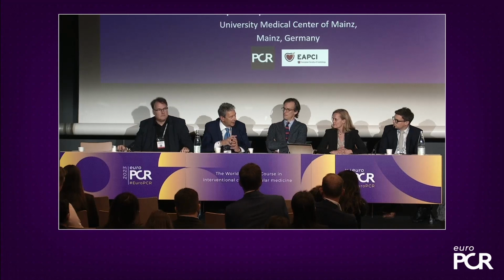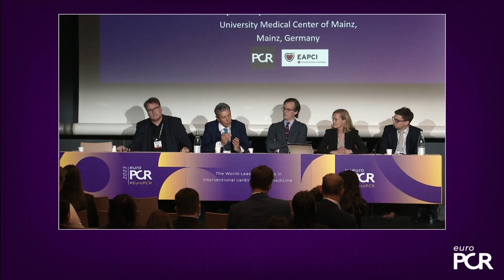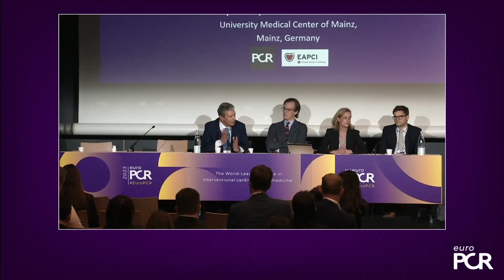But at the beginning of your experience, I think you have to use them together, because you have to understand the different point of view, because the view from the ICE is not exactly the same view as the TOE. So you have to develop experience. But I agree completely with Stefan. I think that in the near future, many procedures now done with general anesthesia will be done in local anesthesia, because at the end it is a venous puncture or two venous accesses.